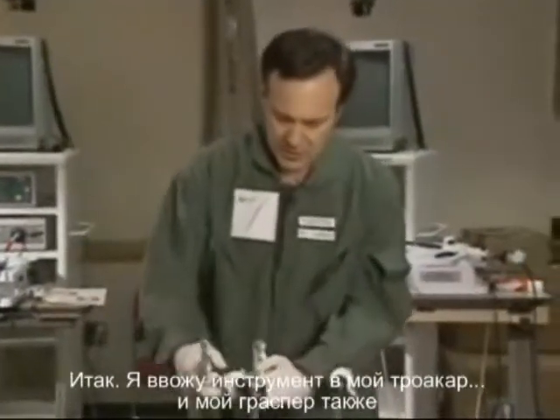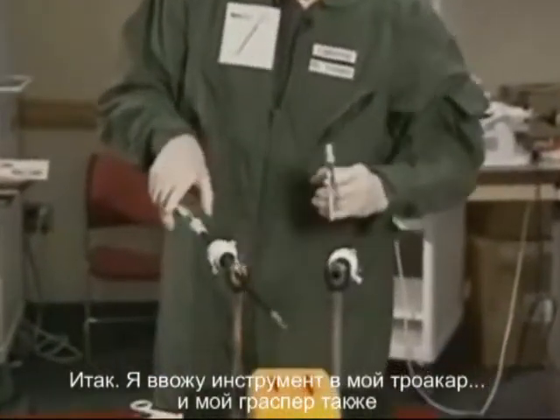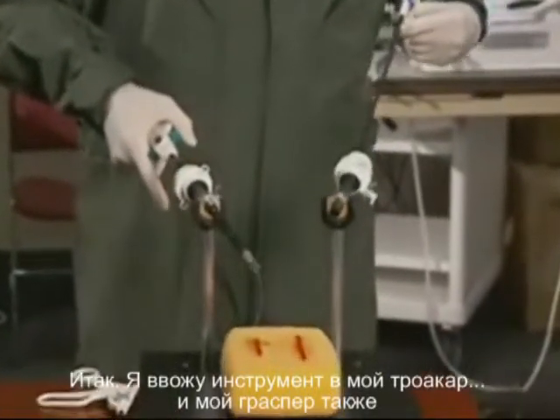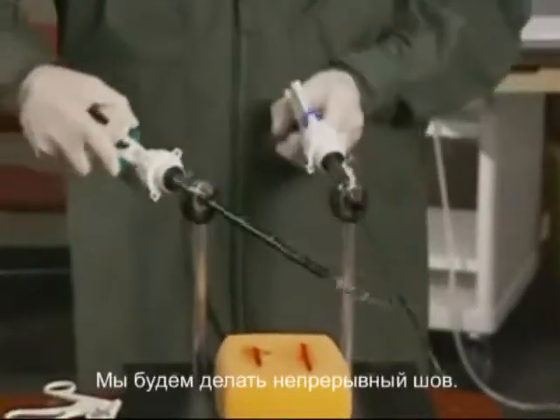Now I'm just going to load the instrument in my trocar and my grasping instrument, and load that as well. We're going to do a running stitch.